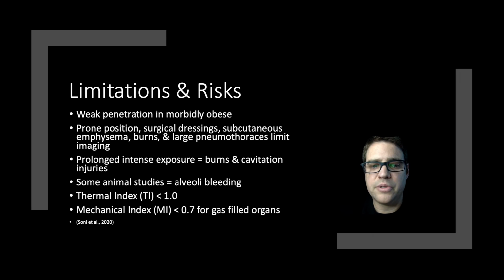Mechanical injury is monitored by mechanical index, MI, and for gas-filled organs, it needs to be kept below 0.7. Finally, as a good rule of thumb, it is prudent to use the lowest frequency possible for the shortest amount of time necessary to obtain an accurate diagnosis when performing a lung POCUS exam.